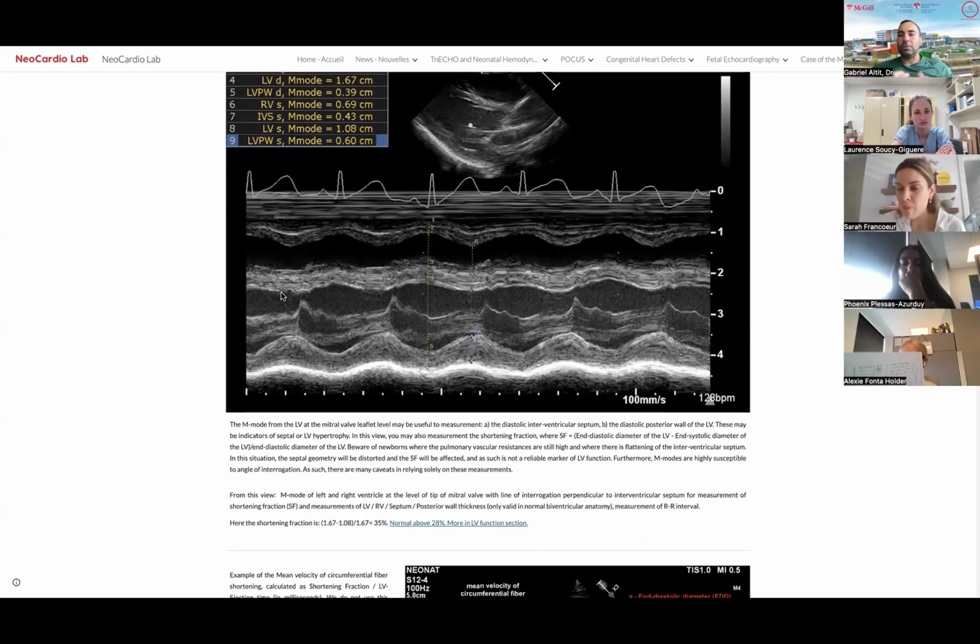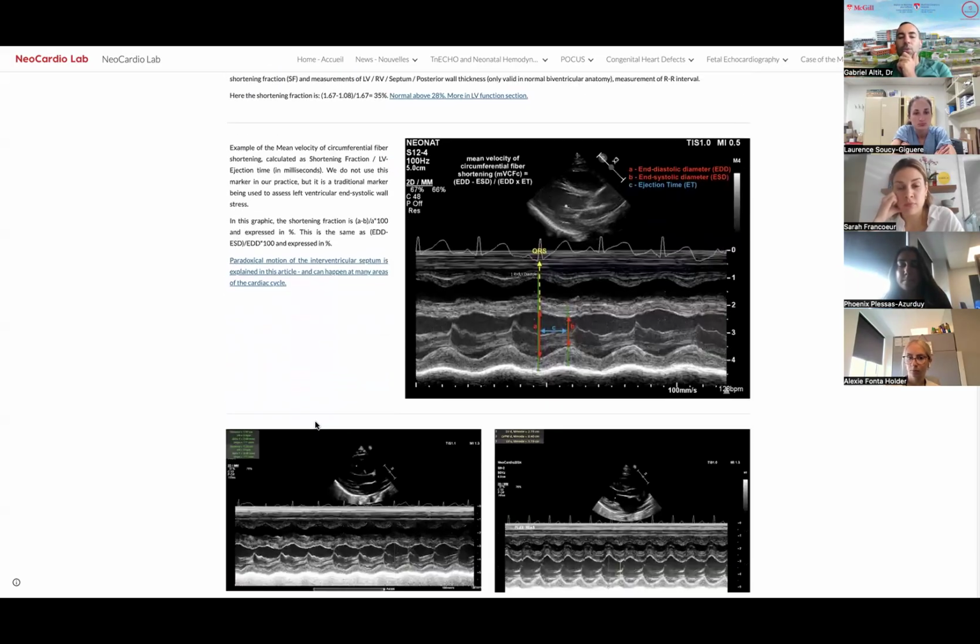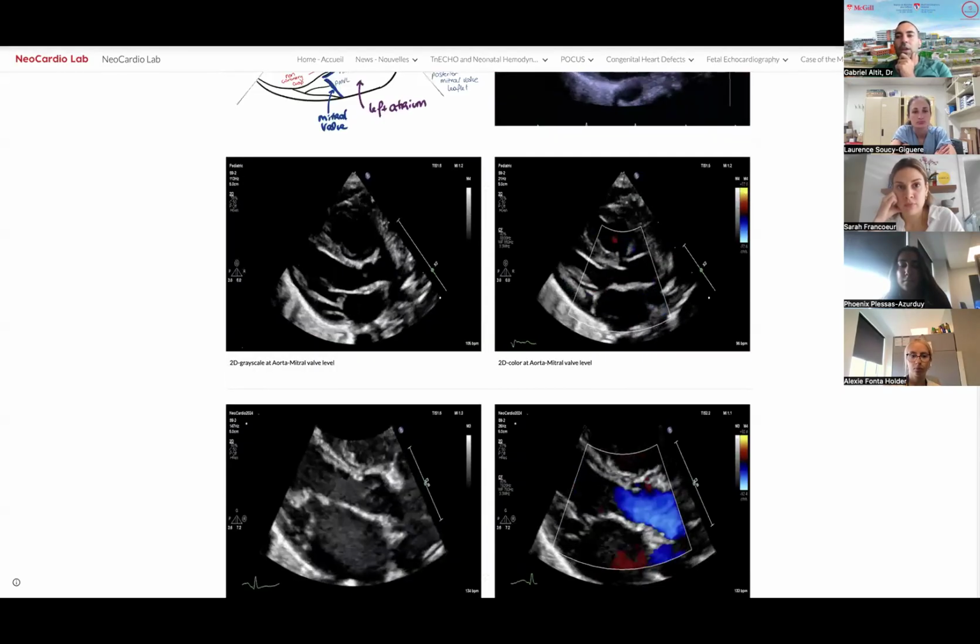And I think part of it is just because of how we hold the probe. So this is my right side, this is my left side. So you have the marker like this, and then you orient like this, and then it goes almost like a full rotation. So for the flow of the imaging, it's easier to do it that way. I don't know if it's that way. I would have to investigate the reason if you're really interested in learning about that.